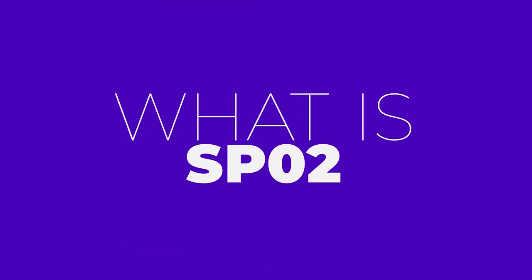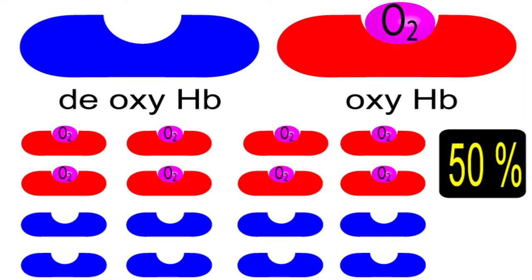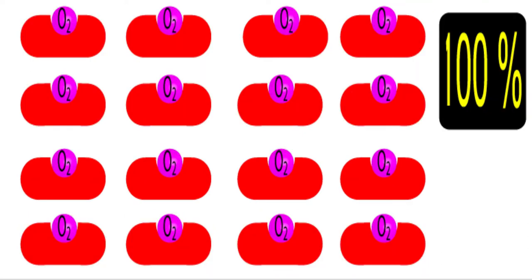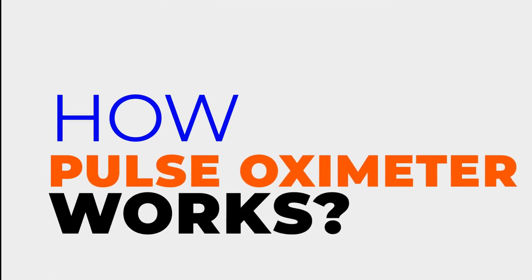Now let me talk about SpO2, the main thing we buy this pulse oximeter for. SpO2 represents the percentage of oxygenated hemoglobin out of total hemoglobin in your blood. If all the hemoglobin in your blood is carrying oxygen, you will get 100% SpO2 on the pulse oximeter.